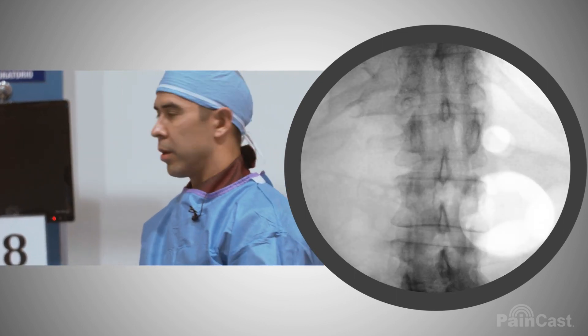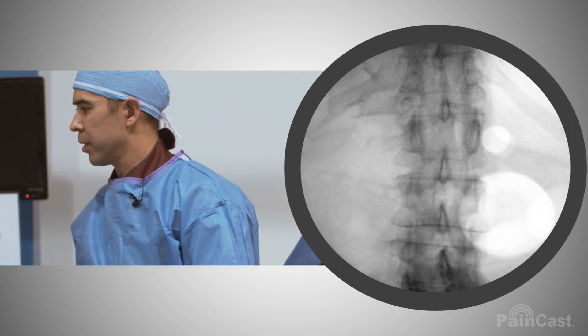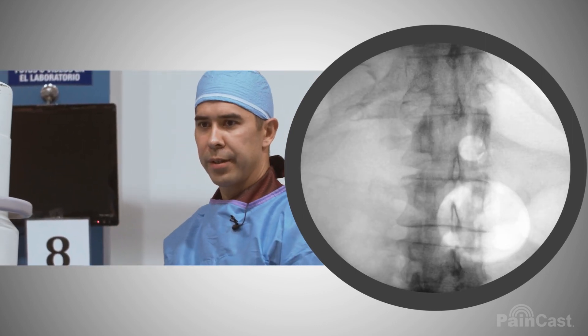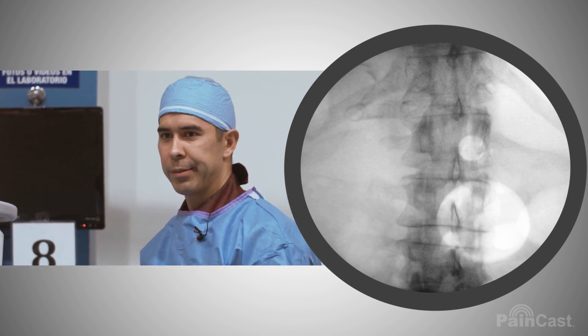Oblique to us a little bit — tiny bit. What's that big circle in there? The table. That looks weird.